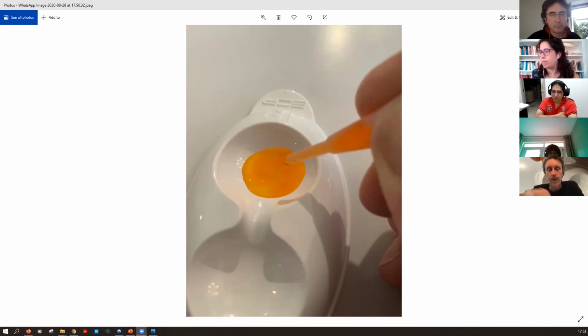So what we use are one of these lens trays. I don't know if you've ever seen them. You could use an old contact lens case, a brand new one, or a specific contact lens case for this product. Because the minim comes out of its packaging sterile from the fridge, you squeeze the contents of the fluorescein minim, the contents of the anesthetic minim, and the contents of the sterile ampule, and all of those mix together. Then with the tip of one of the minims, you reverse suction into the two minim ampules, and you have a mixed, consistent fluorescein mix with wetting and anesthetic that you can pretty much use, and you know it's always going to be consistent per day. So you can use it during the day.